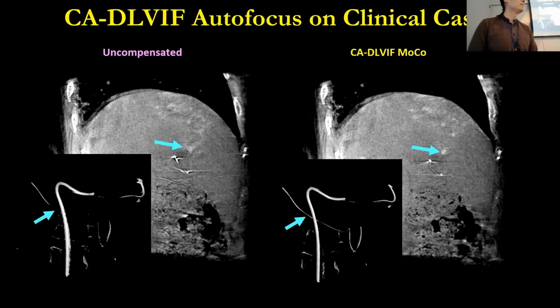I wonder if you are also interested in taking a little bit of a shortcut to deal with the residual artifact in an empirical way, rather than pursuing accuracy of the motion estimation and compensation. I like that approach and mindset, but still there might be some way to deal with these residual artifacts in an image processing fashion or something. What do you think about that?